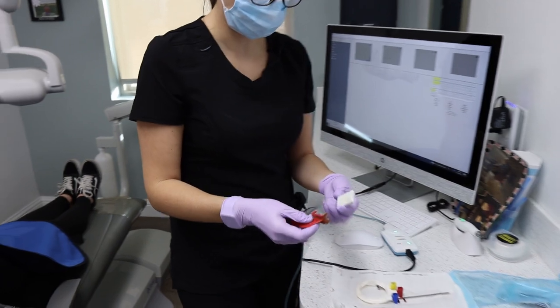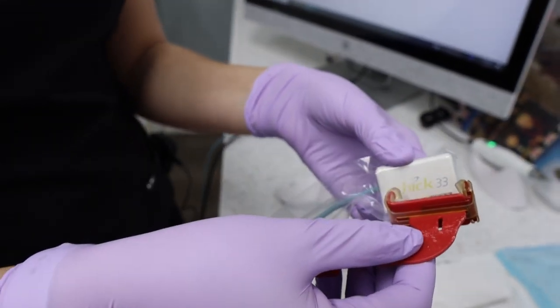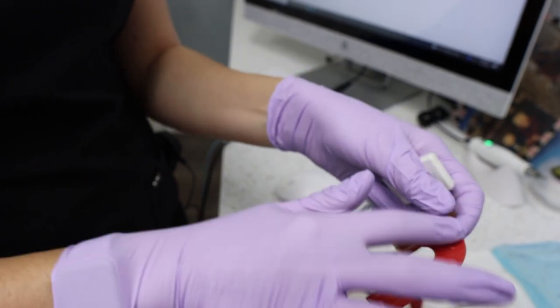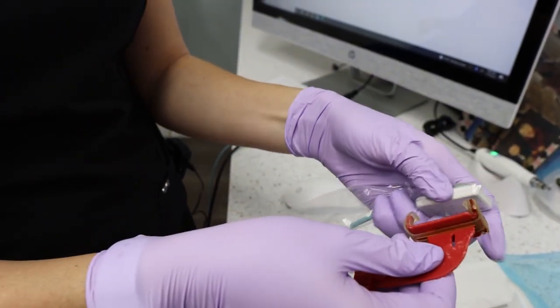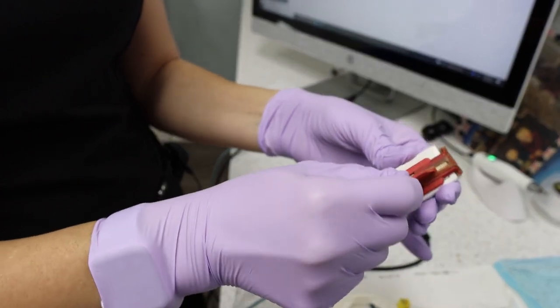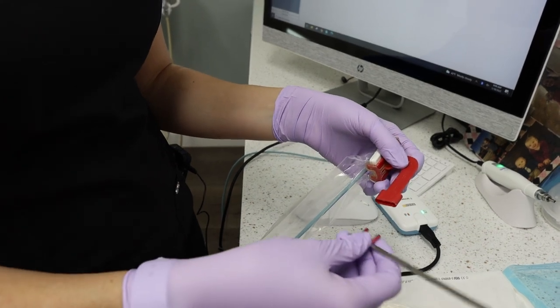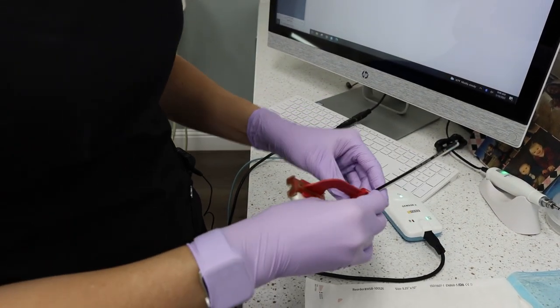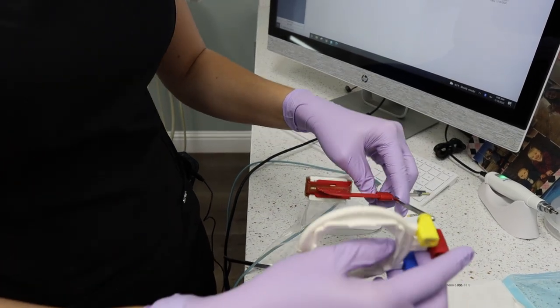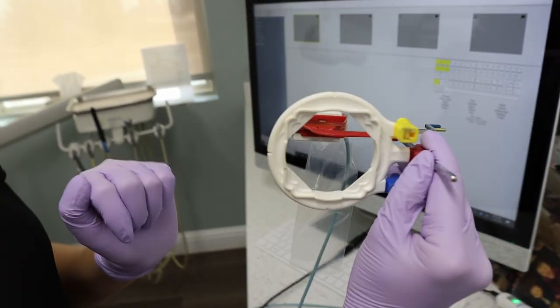You're now going to place the sensor holder on the sensor. When you place this on, you want the arm and the cord of the sensor facing the same way. You're then going to attach the arm, and when you place the ring on, you want to be able to see the sensor through the ring.